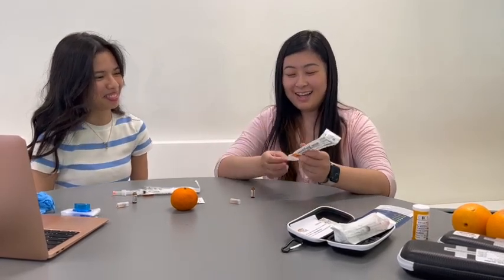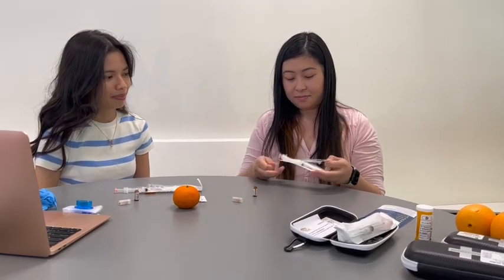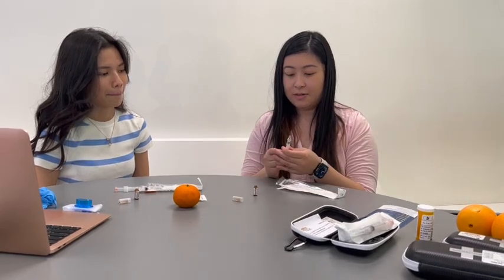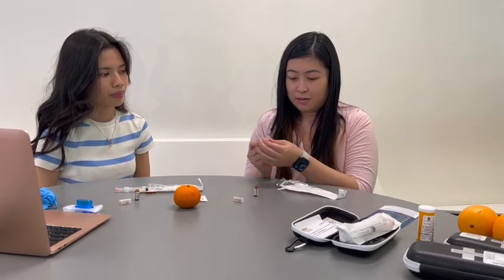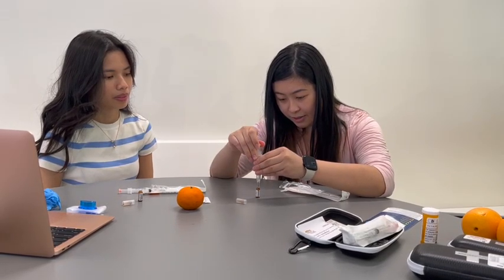Cut hard. And then the syringe. And then you pull the cap off. And then to draw up everything.